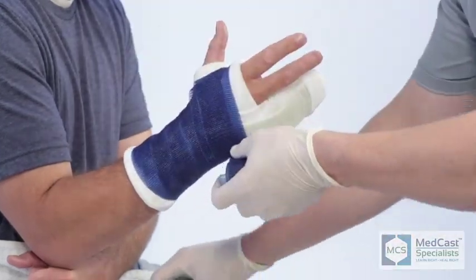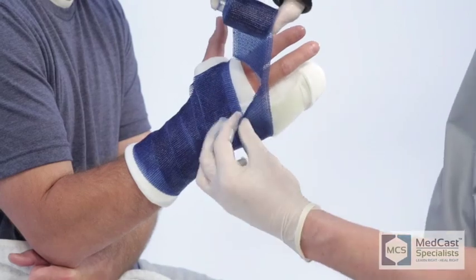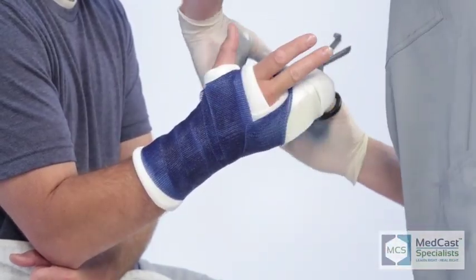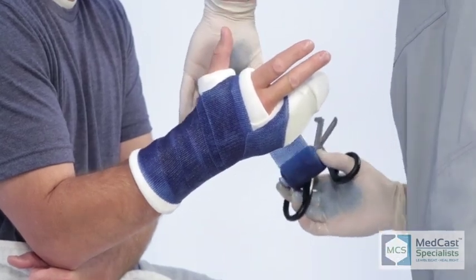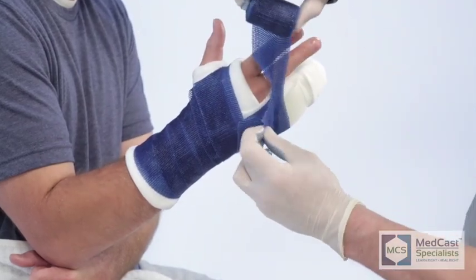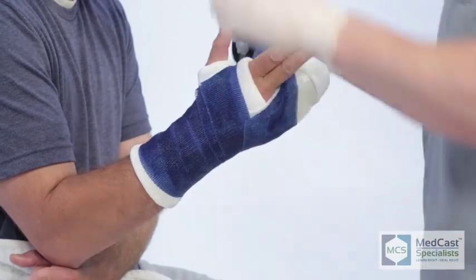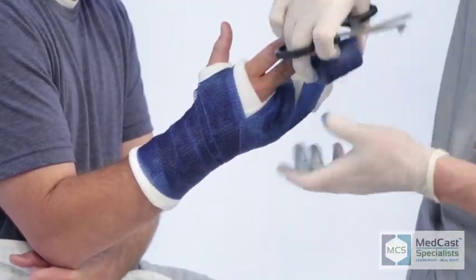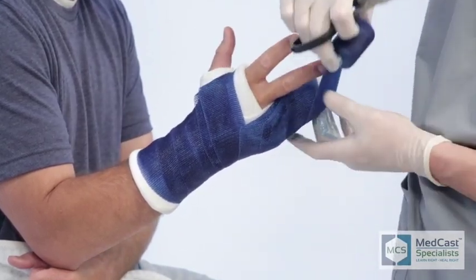I've found that if you start on the proximal end and work your way distally, you can come back and catch just past the web space proximally and it works out pretty well. You're catching your tails on the backside of the thumb — right now they're all left open, so you've got to come down and catch everything distally. Cut right to the very end of the fiberglass, leaving length on the backside to cover the MCP of the fourth and fifth. Cut not quite as deep to give yourself room to get through there, coming longer out on the distal end of the fourth and fifth fingers.